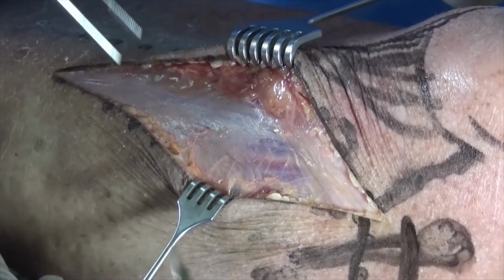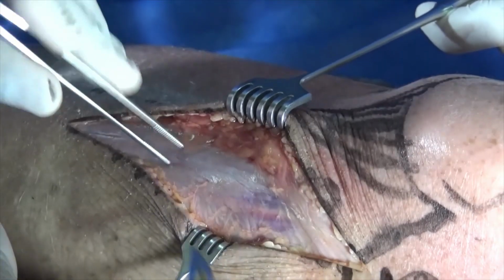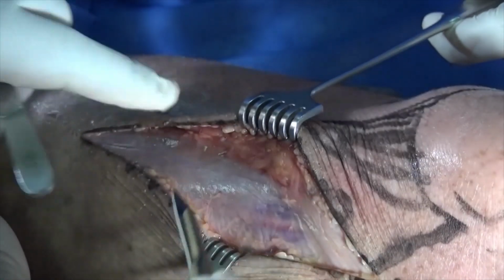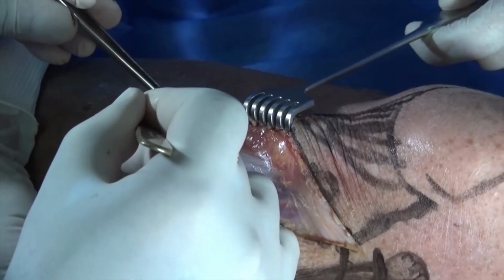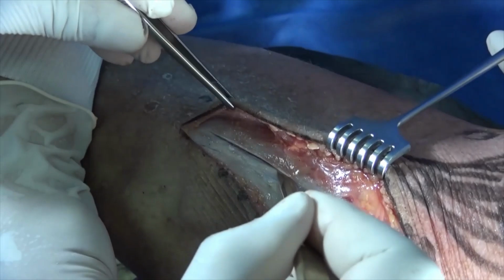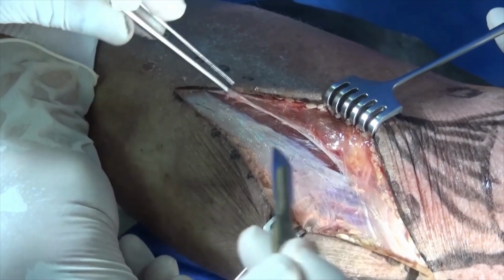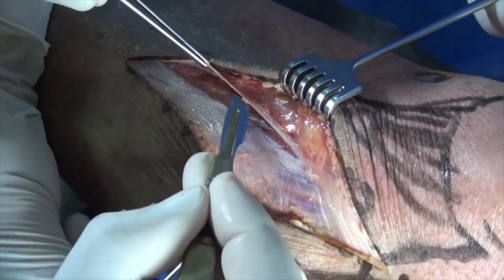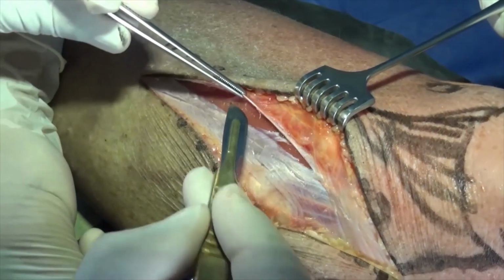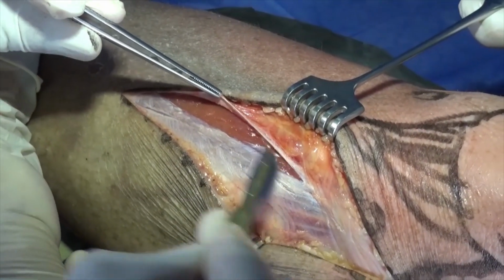Okay? So there are two kinds of people. Those who believe that you open the fascia like this, blade's not very sharp. Okay, and then you lift it up and you peel your tissues. You can do it with either sharp dissection, or you can do it with the periosteal elevator like you saw the last time.